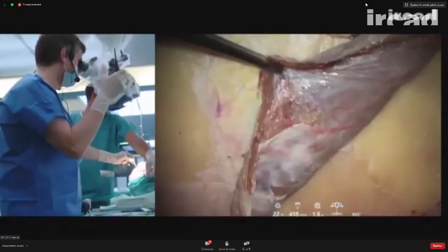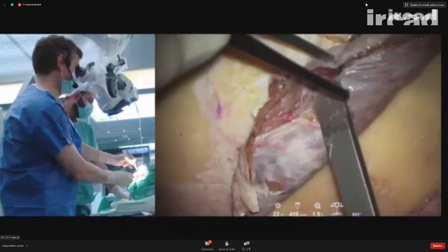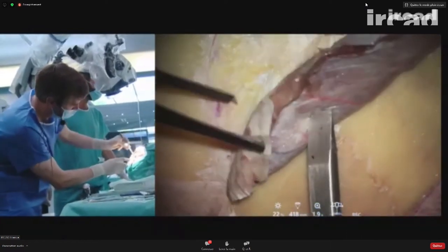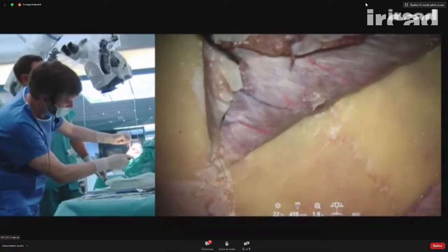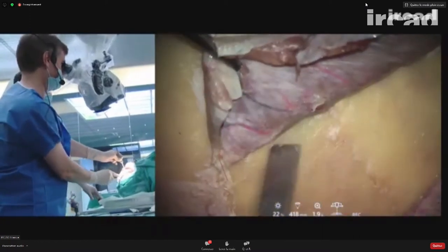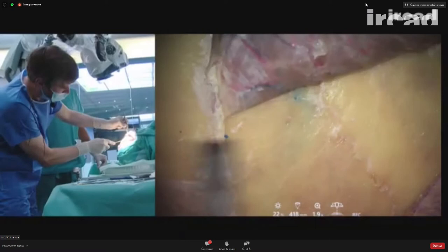You see the vessels at the deep surface. And this is really what I want to keep intact. So this movement is from down up. If you go reverse, up down, you will not be able to keep this periosteum. The sharp angled instruments like this are perfect to do that.